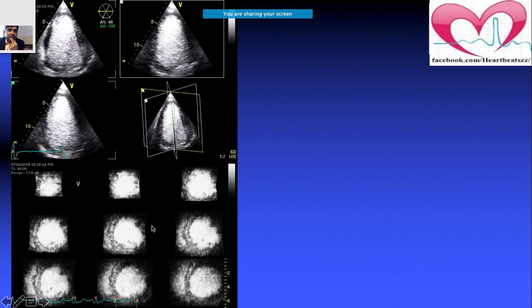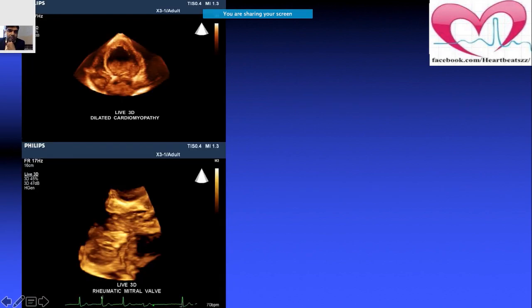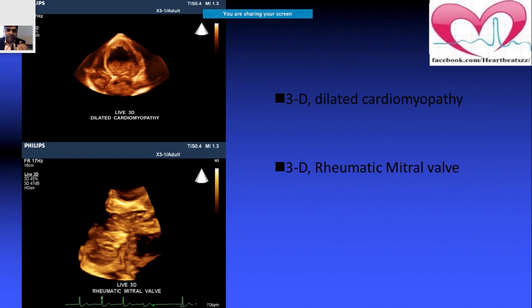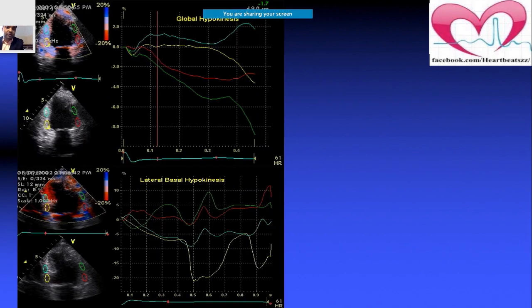This is contrast echo being performed in different views — apical view and short axis view. This next image shows 3D imaging. The first example is dilated cardiomyopathy — there are special echocardiographic parameters that define it. The lower segment shows rheumatic heart disease, and we will be discussing the parameters for that shortly.